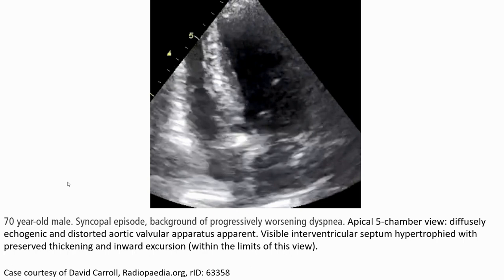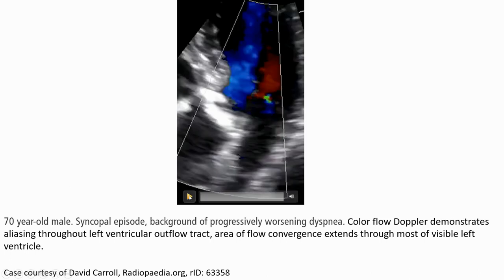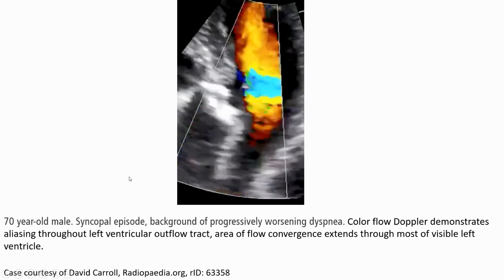This is a case of a 17-year-old male with a single episode in the background of progressive exertional symptoms. Five-chamber view shows an echogenic and distorted aortic valvular apparatus. The ventricular septum hypertrophy is visible with preserved thickening and inward excursion. Color Doppler demonstrates aliasing throughout the left ventricular outflow tract area, extending through most of the visible left ventricle.